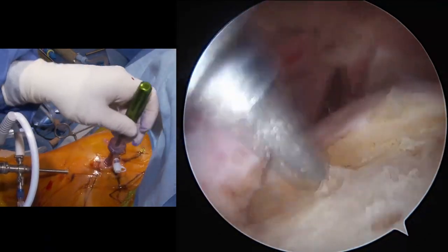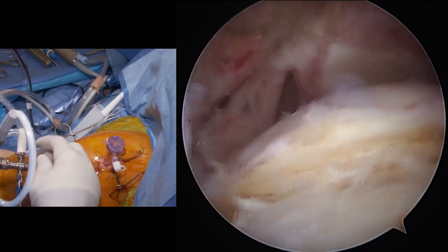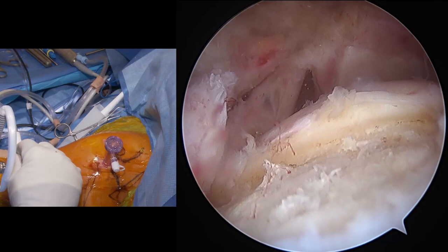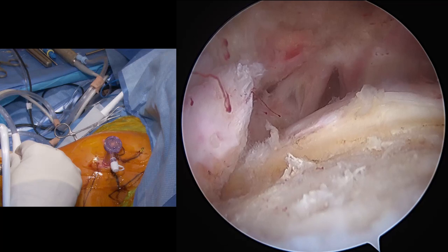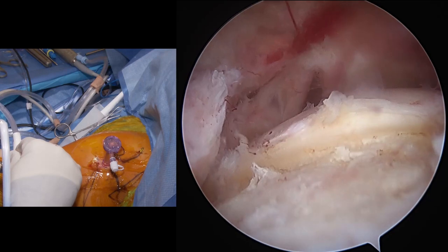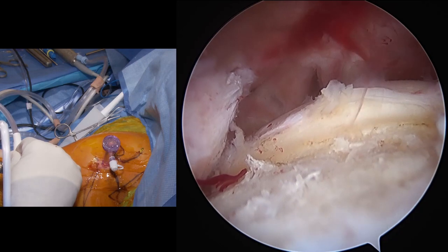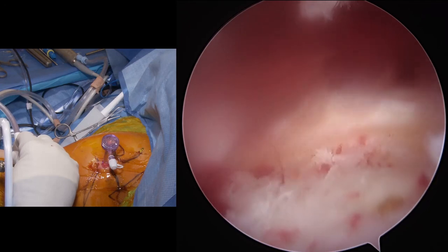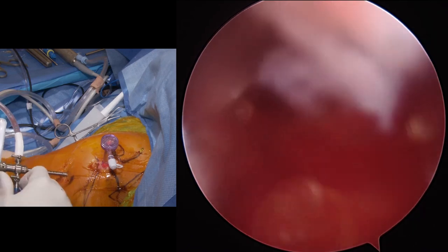Okay. If we're lucky, we can see sometimes once we've done that, we can turn our flow off and turn a little bit of suction on, and we should see the bone marrow coming up through the holes, hopefully. There are some. That's kind of creeping up there. There we go. So we can show we got some good blood supply there. Okay.